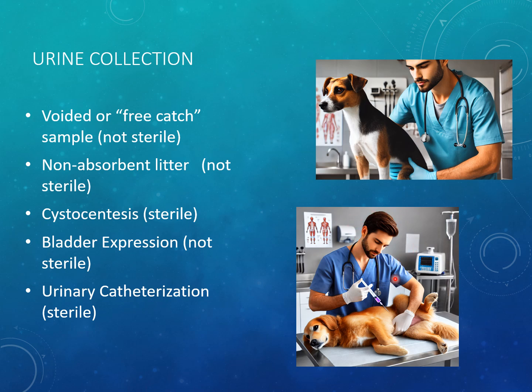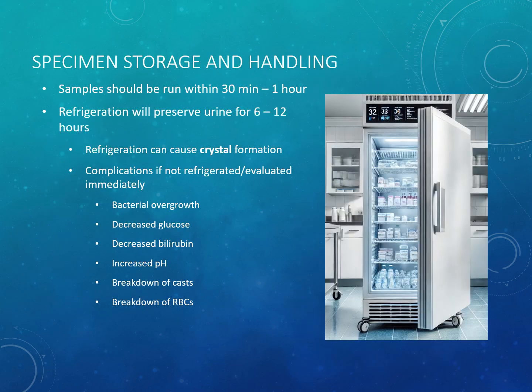The catheter does have to be placed, so the animal would have to be sedated for that as well. So as far as specimen storage and handling, urine degrades much faster than blood, for example, and urine samples should be run within 30 minutes to an hour.